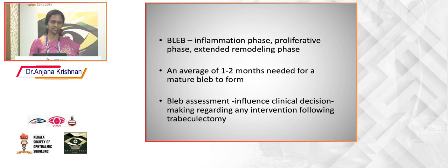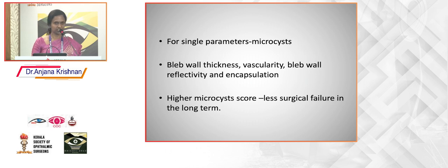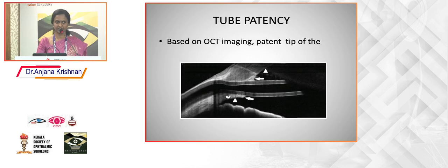The importance of imaging is that when you do it at the right time and detect these changes, it may help us assess the intervention following the trabeculectomy. Whether a laser suture lysis, a mitomycin injection or a needling will help or not can be better evaluated using these imaging technologies rather than just by a slit lamp or a photographic method. Among single parameters, it is the microcyst which shows a good functioning bleb, and other parameters, as already mentioned, will help. As already discussed, I will just go through the slides fast.